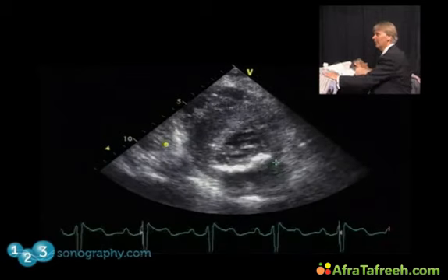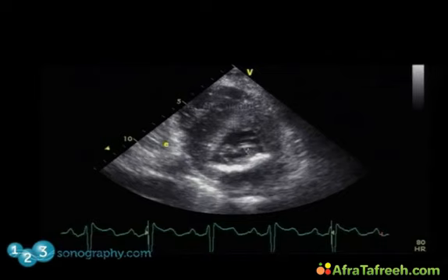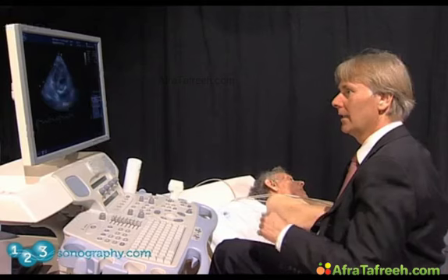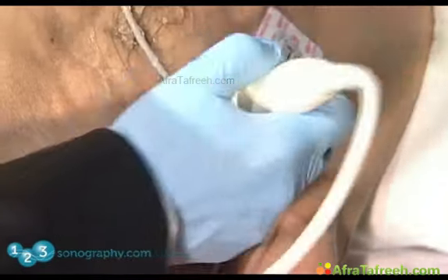We can even do some form of planimetry here. So very difficult to see the contour. I don't know if I'll really take this for granted, but it will give me at least some clue as to what the opening area is: 1.5. Okay? So this is just some morphologic aspects.